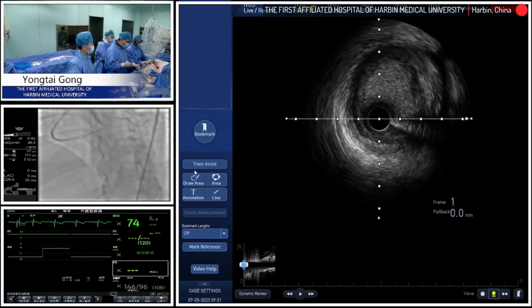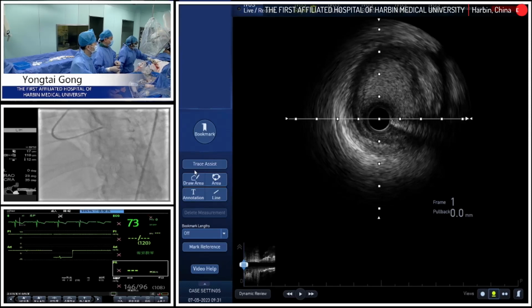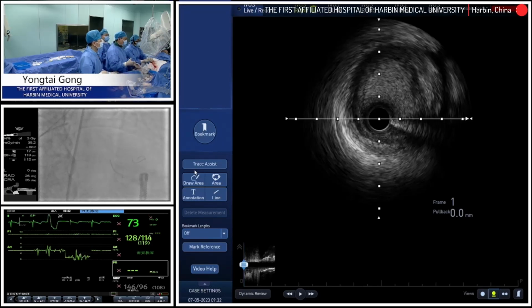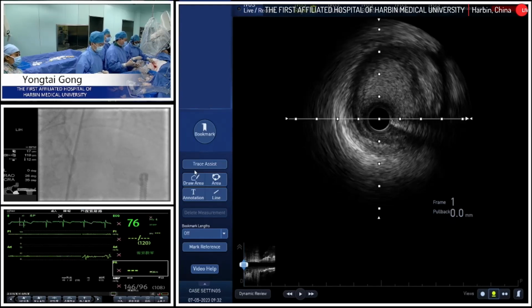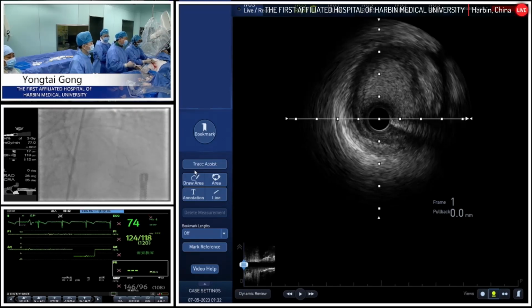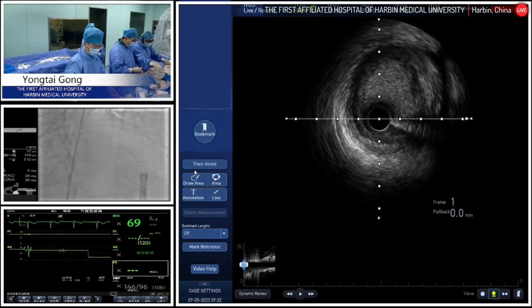It's a relatively very big diagonal branch, and we know that keeping it open to maintain the recanalization, to maintain the important bifurcation, for the bifurcation lesions is of key importance. For example, like this patient, he has only one diagonal branch, and then we need to keep it open because it's of great importance. And if, for example, the diagonal is not so long, and also the diameter is not so big, for example, less than 2 millimeter in diameter, the length less than 70 millimeter, maybe it's not so important because the perfused myocardium is less than 10% of the left ventricular.